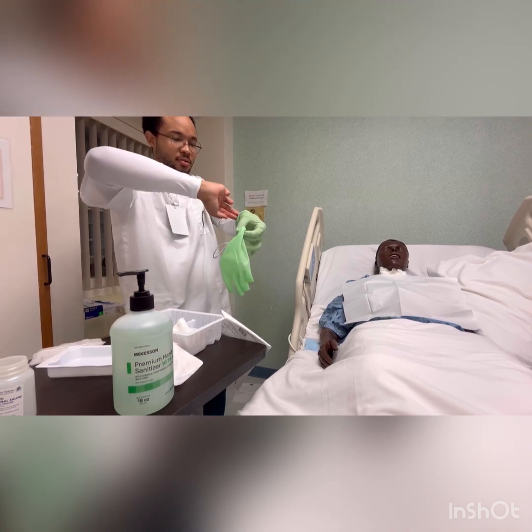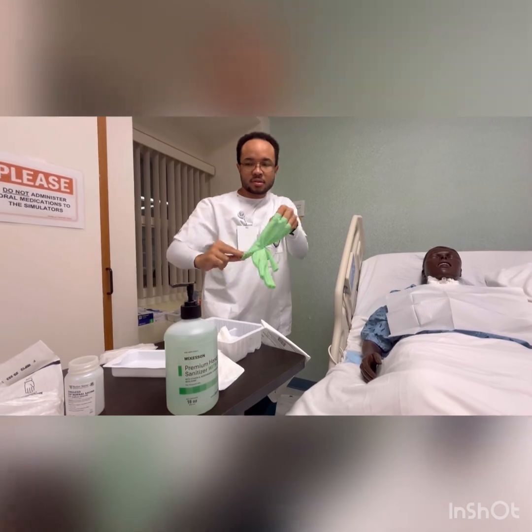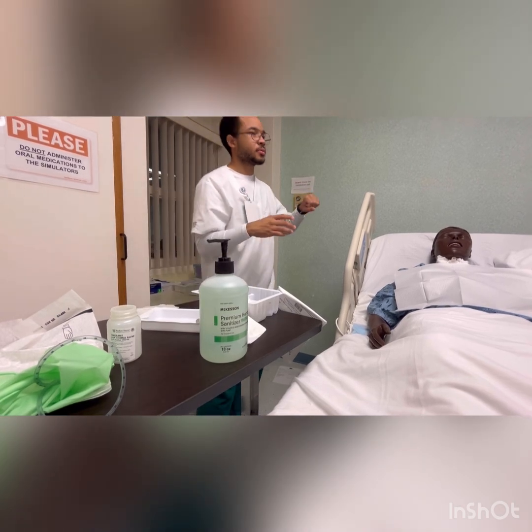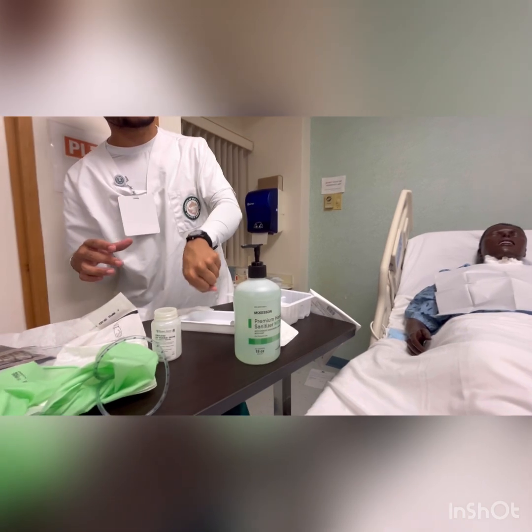Replace the oxygen source if the patient was removed from the source during the suctioning, and discard the glove and catheter in the water-resistant receptacle designated by the agency. Using the non-dominant hand, clear the connecting tube of secretions by placing the tip into the container of sterile saline.